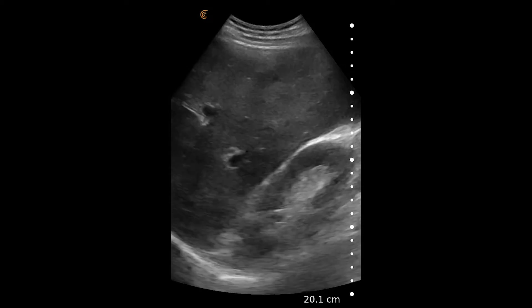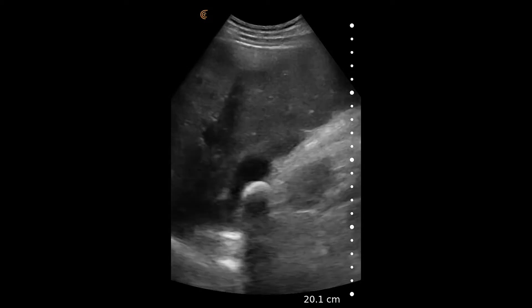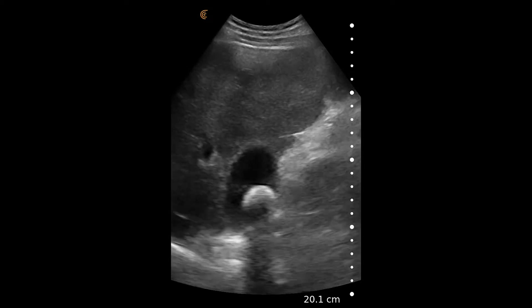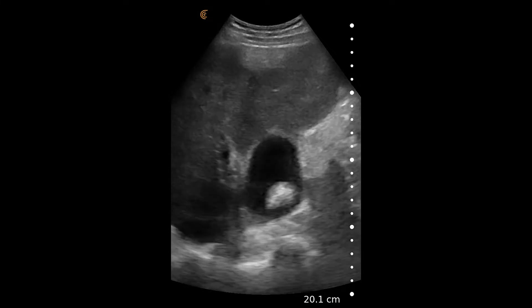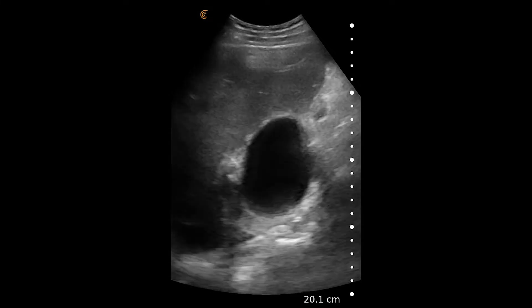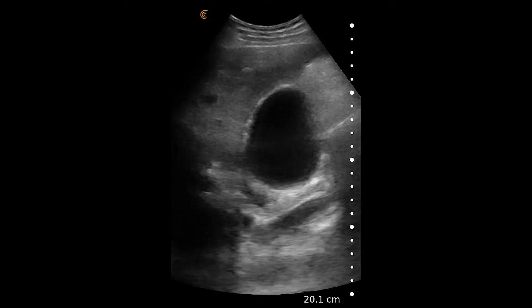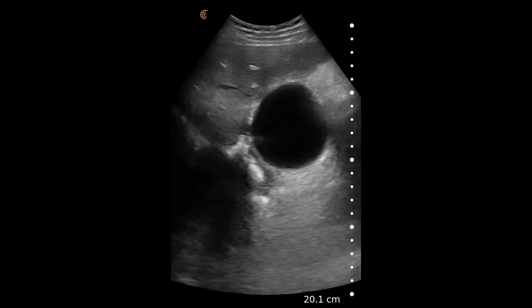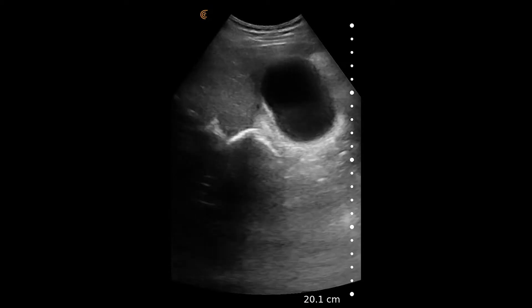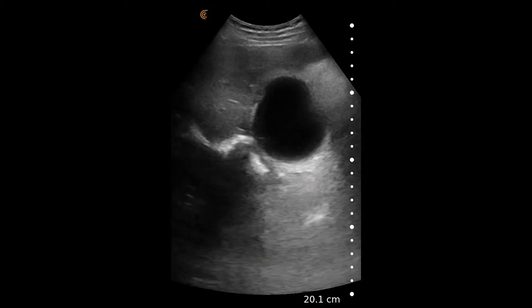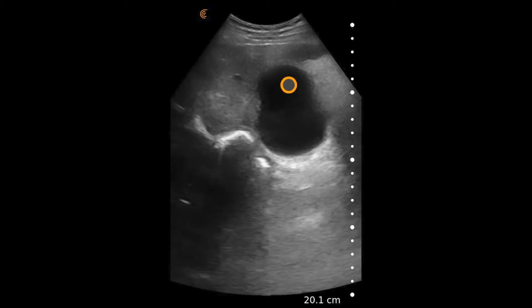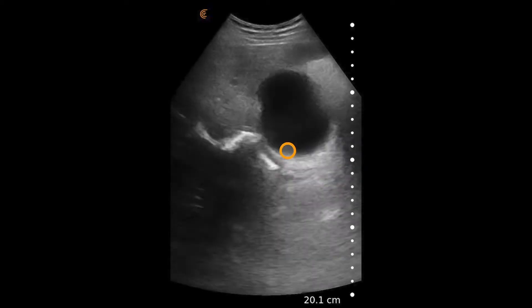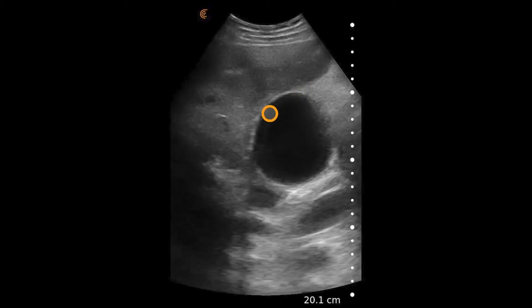In this video we see the curvilinear scanner on an abdominal preset in approximately transverse to sagittal plane in the right upper quadrant in a patient presenting with right upper quadrant and epigastric pain. Immediately we see the gallbladder come into view, and as the scanner goes down along the gallbladder we see findings suspicious for an enlarged gallbladder.